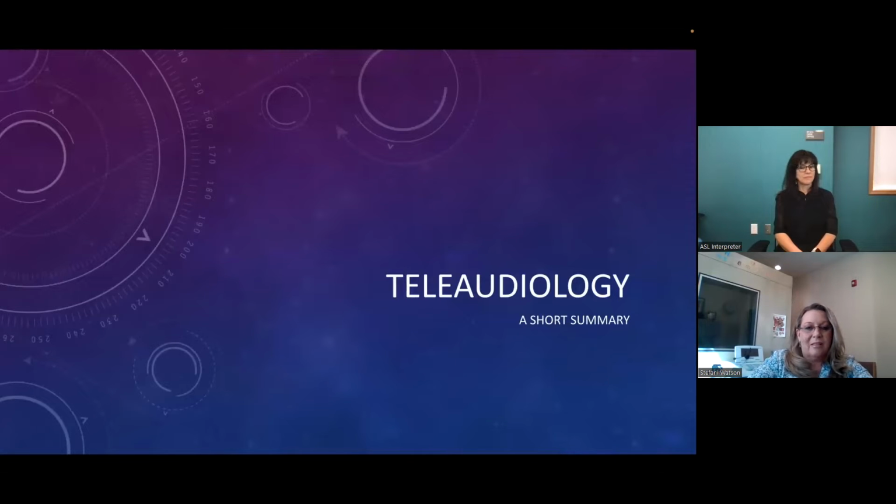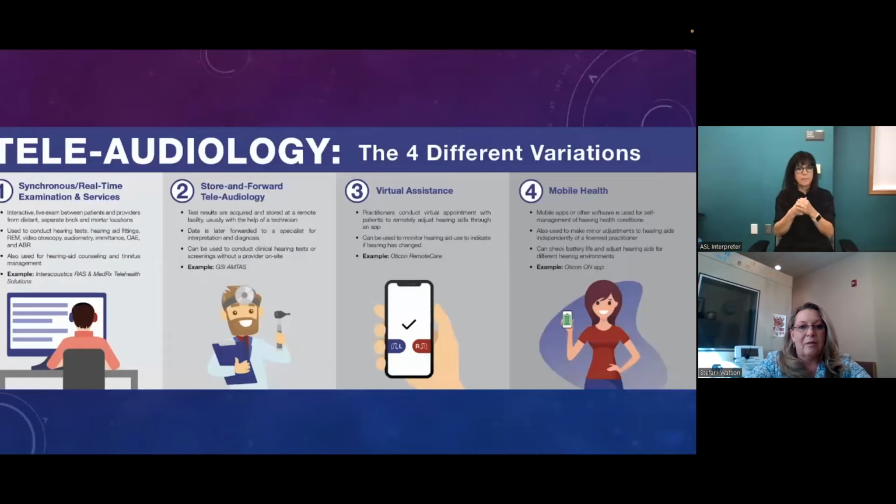We are going to just touch a little bit on teleaudiology. A lot of people have had questions about this or called me about this, and so we're just going to do a short summary. Okay, so there are 4 types of teleaudiology, and we're going to talk mostly about 2 of them.